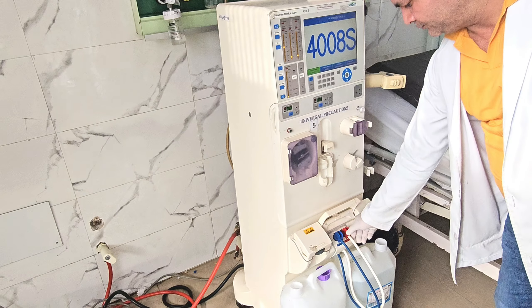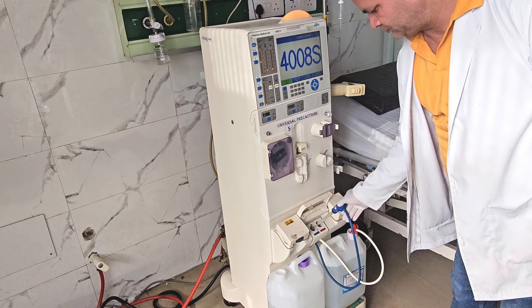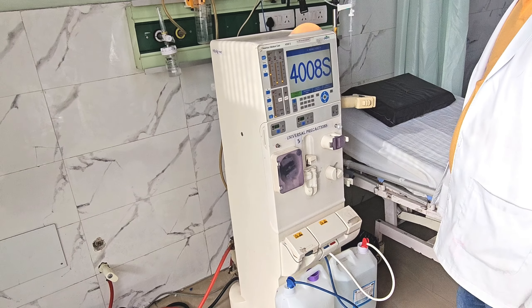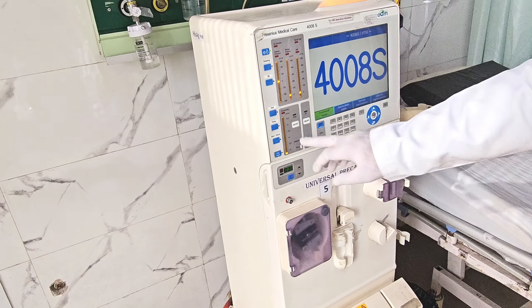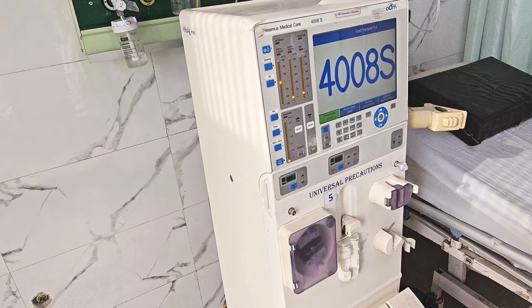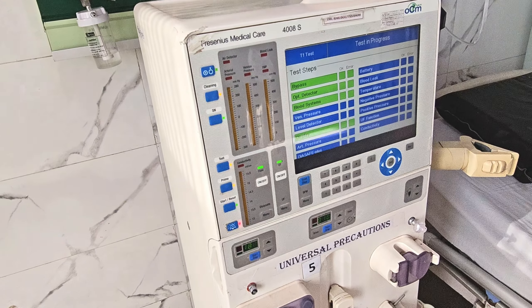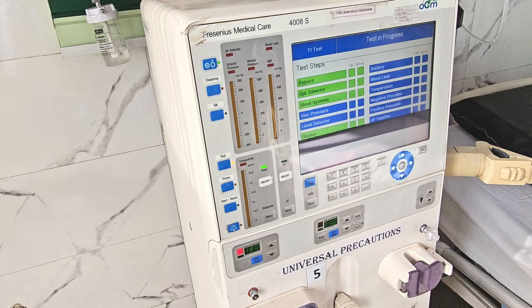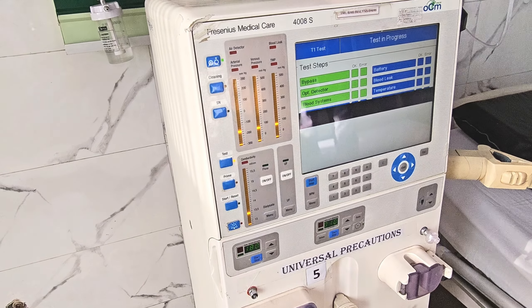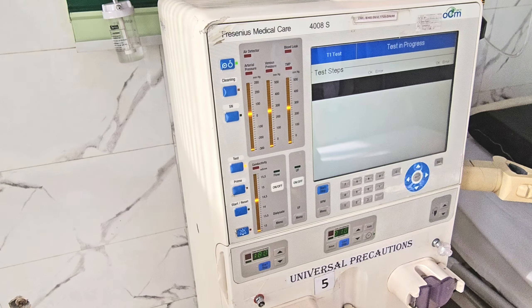Once the machine is switched on, it will go into auto-testing mode. He is now taking the coupler and putting it to the respective chamber — part A which is the electrolytes, part B which is the bicarbonate. The two white cans have been connected to their respective couplers. Now he presses the test mode button, and the machine will go for auto-checkup of all its parameters like blood leak alarm, ultrafiltrate pump, and bypass functioning.